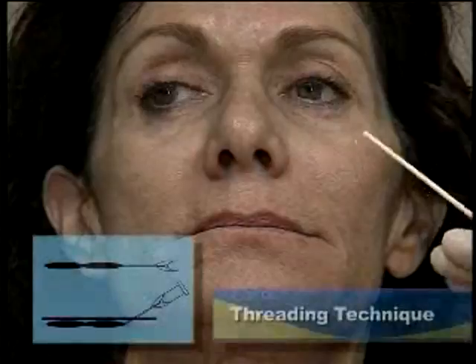Here's the nasolabial fold. And my goal is to treat this fold. Now, how I like to do it is a fanning technique. And there's multiple methods. You can do a threading technique.